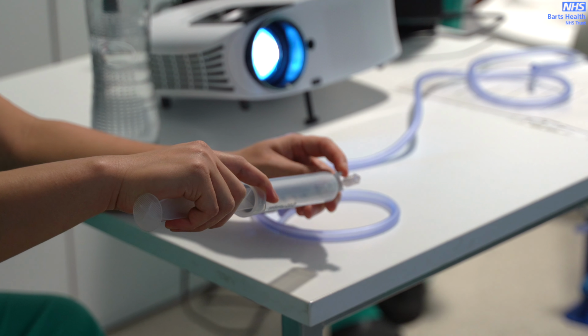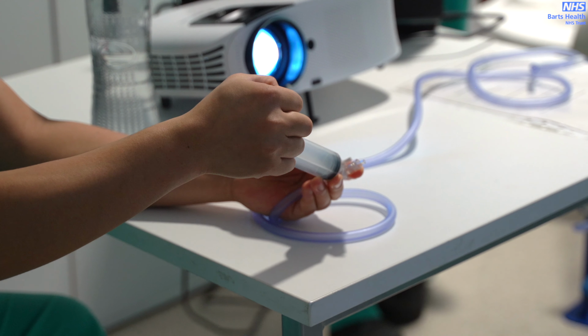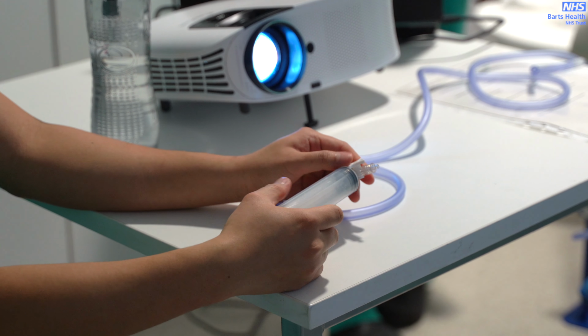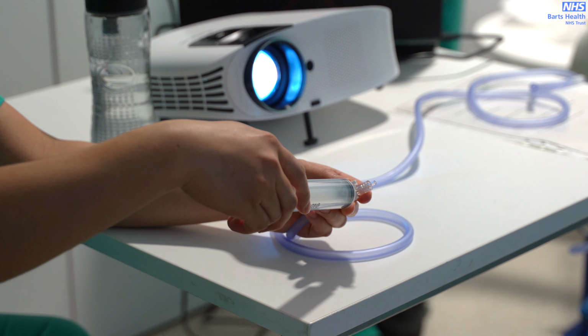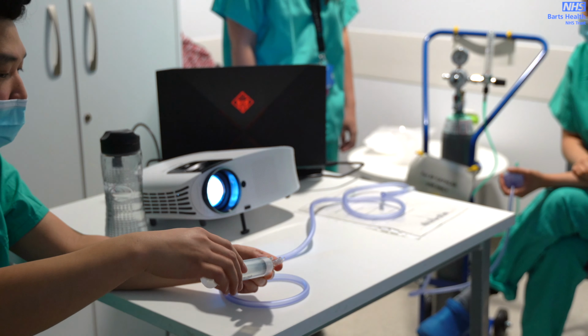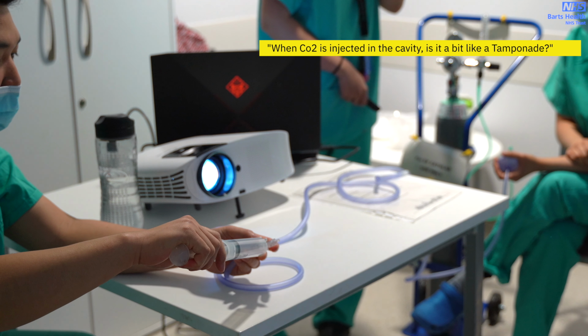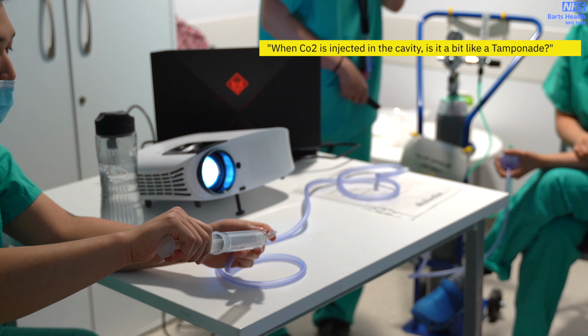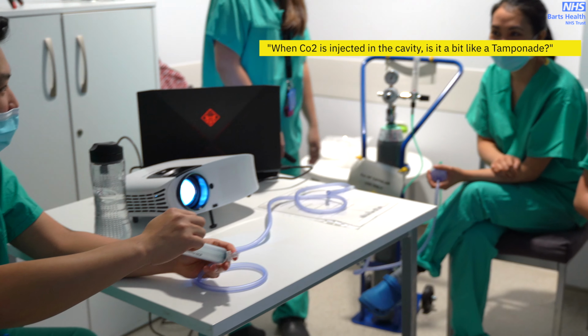So slowly, just slowly. They will inject up to 150 ml of CO2, so don't yank it up to 10 liters, just 1 liter. When it goes into the cavity, it's a bit like a tamponade, so you have to look at your patient.